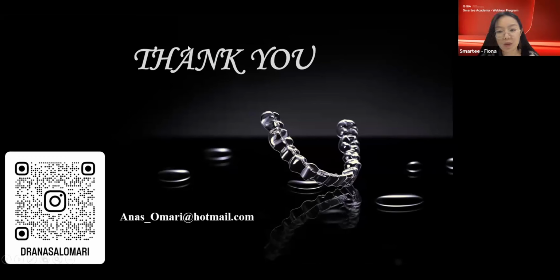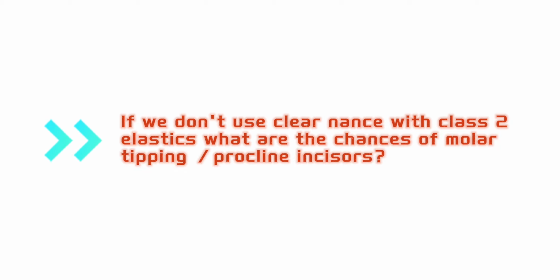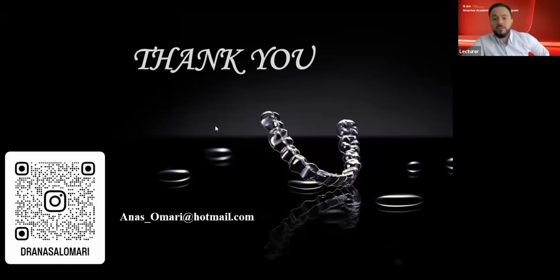All right, there is one question, Dr. Anas, asking: if we don't use clear Nance with clear class 2 elastics, what are the chances of molar tipping or proclined incisors? Of course, there's always a chance of losing anchorage while we apply the distal forces to the molars, and that's why we need to be careful about these movements. There is a high chance of anchorage loss, but honestly, if it's a very mild movement, up to 2 to 3 millimeters, that would be minimal. Due to the fact that the aligner is covering the occlusal surface of the teeth, this will prevent the tipping.